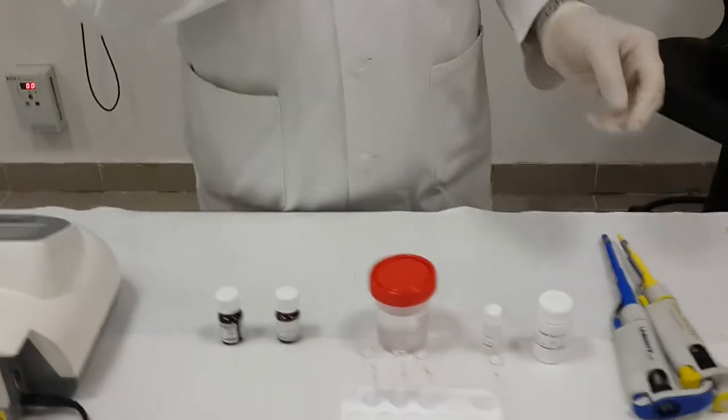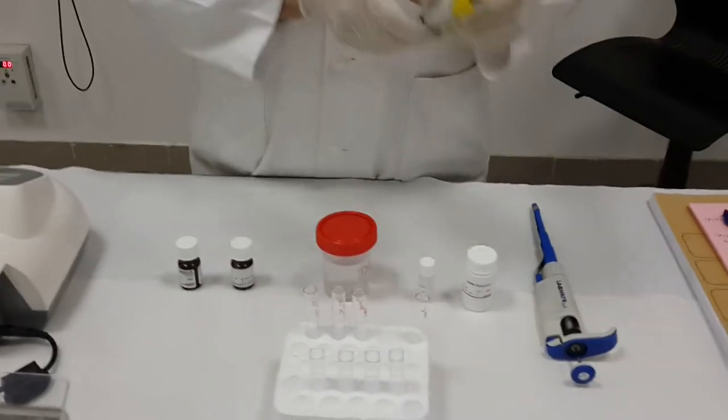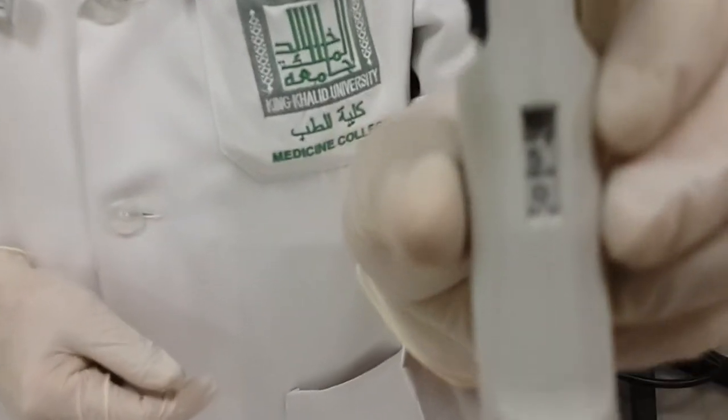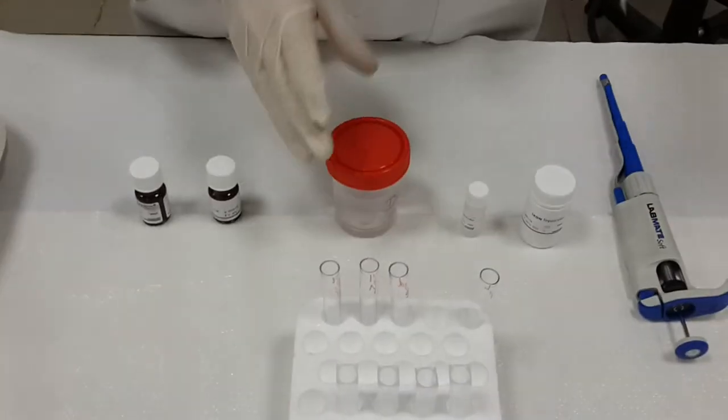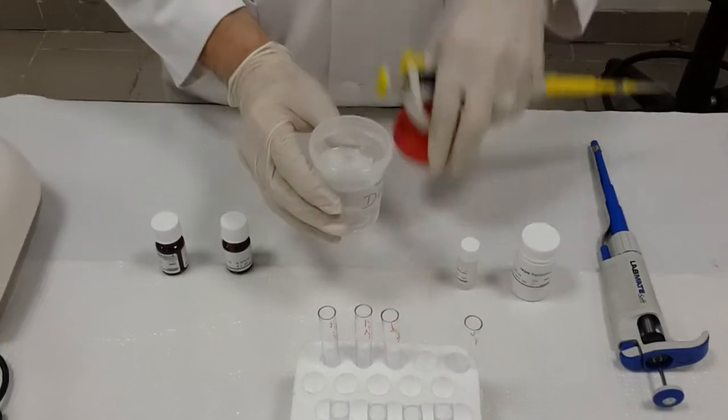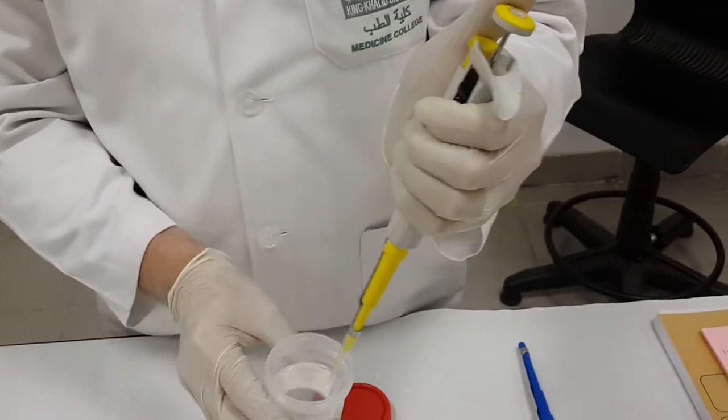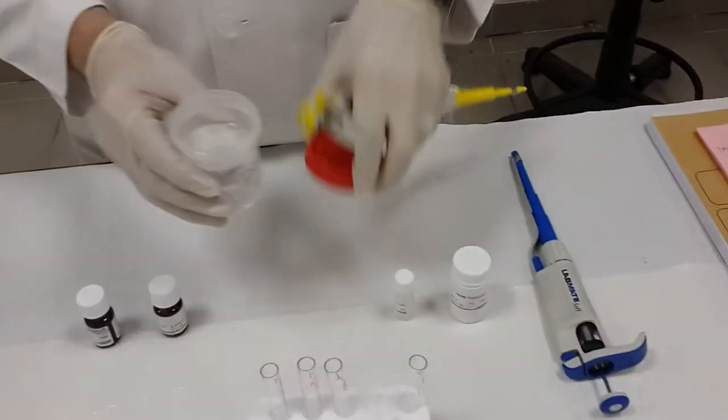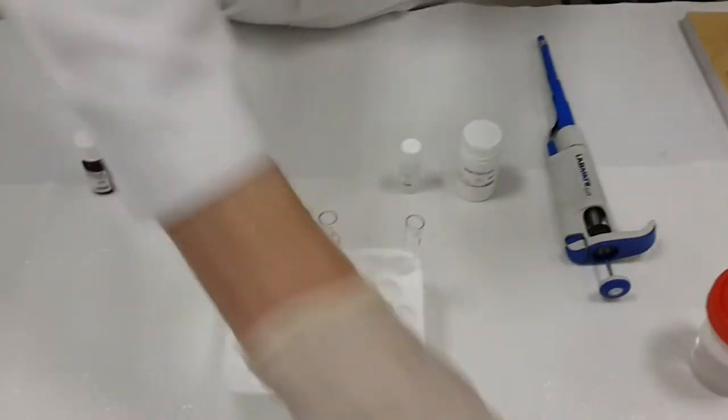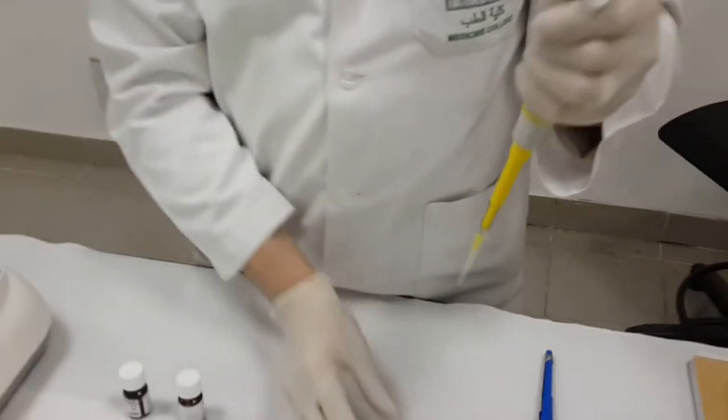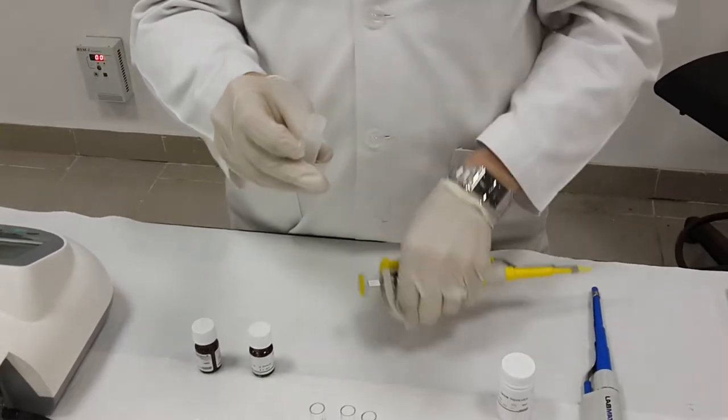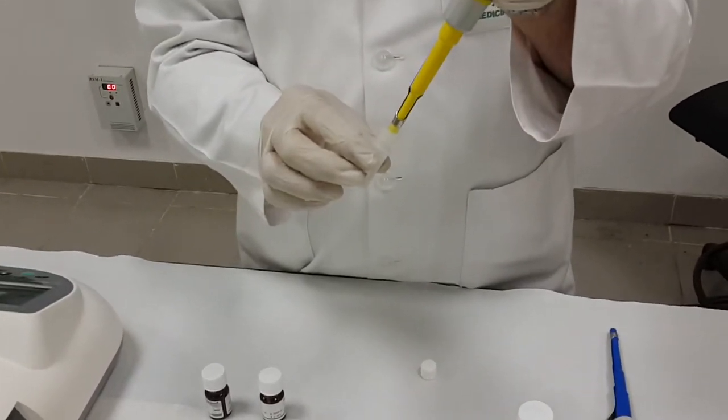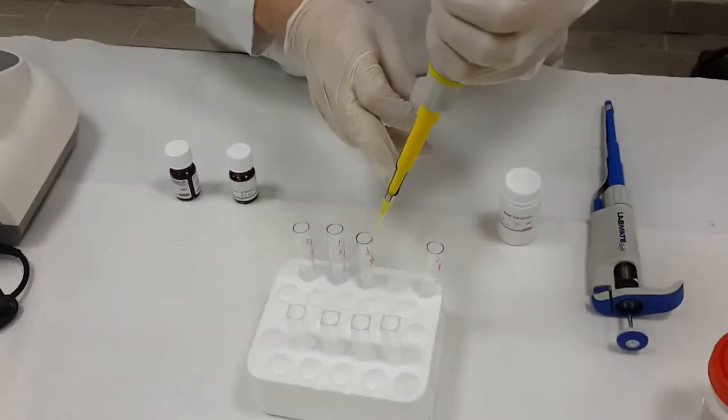Then I will take now from each one of these samples around 50 microliters. So I will use the yellow tip. As we said earlier, you have to fix it very well. Then for the blank, I will take 50 microliters of distilled water and put it in the tube of the blank. Then I have to discard the tip in the biohazard basket. For the standard, 50 microliters, I put it in the tube of the standard.